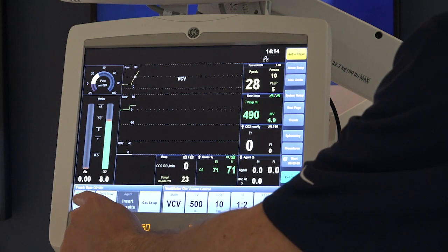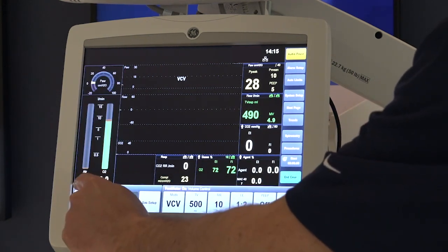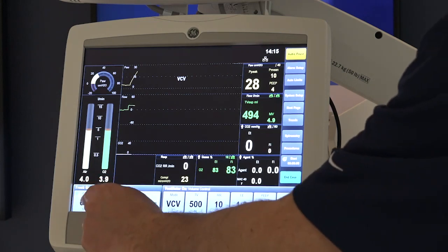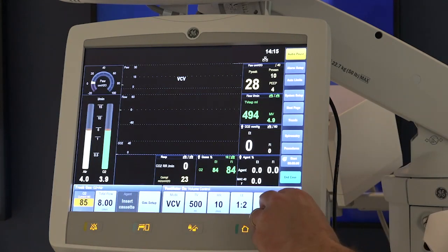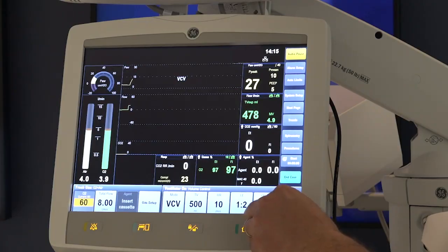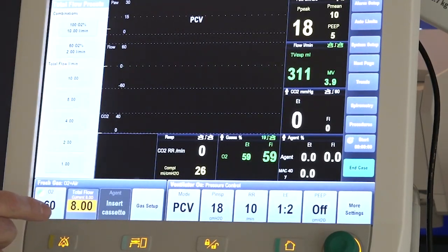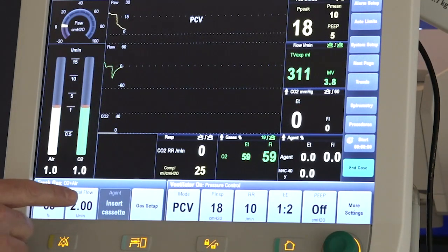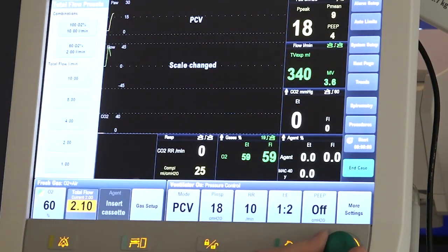To change your O2 percent, press the O2 percent quick key. Select from the quick pick menu or manually set by rotating and confirming on the com wheel. To set your flow rate, press your flow rate quick key and select from the quick pick menu or manually set by rotating and confirming with the com wheel.